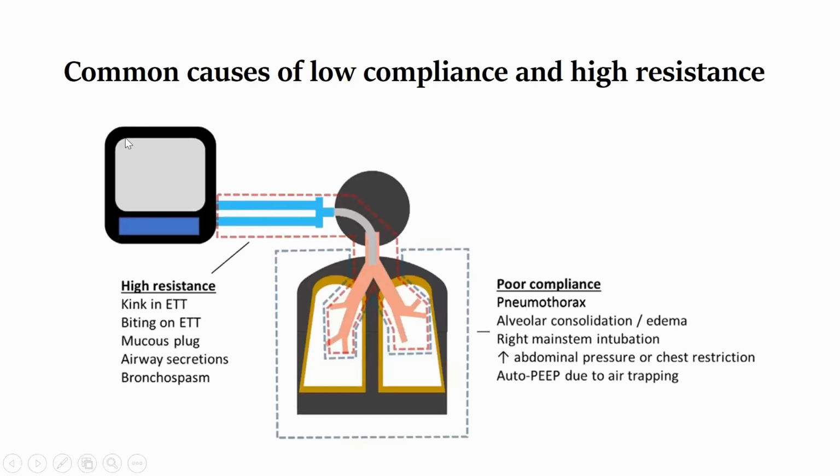So the problem you see, and the alarms you will hear and see on the graphic interface on the monitor, will be a very high airway pressure. But high airway pressure could also be caused by a lung problem. So there is a specific way of telling whether it is really an airway problem or a lung problem. It depends on the compliance assessment you will see later.